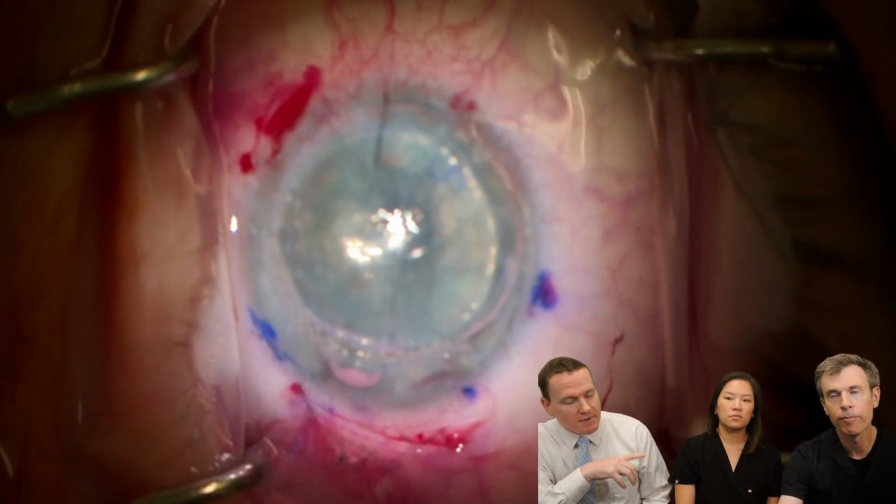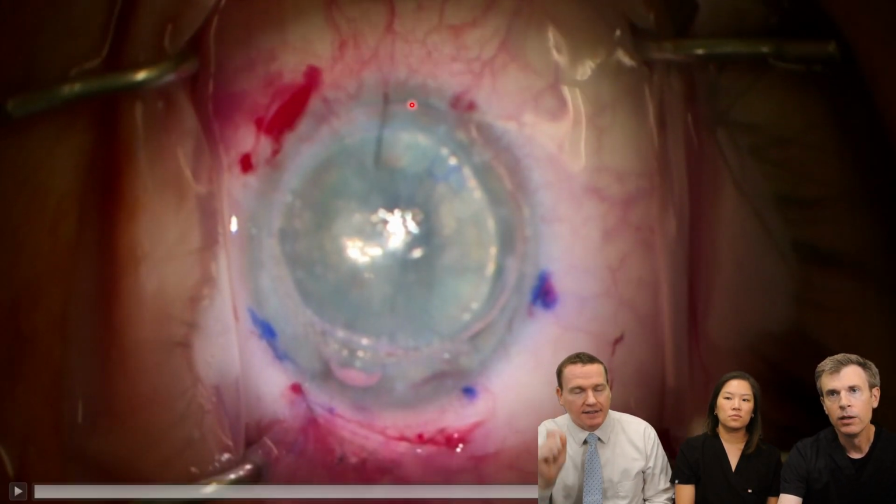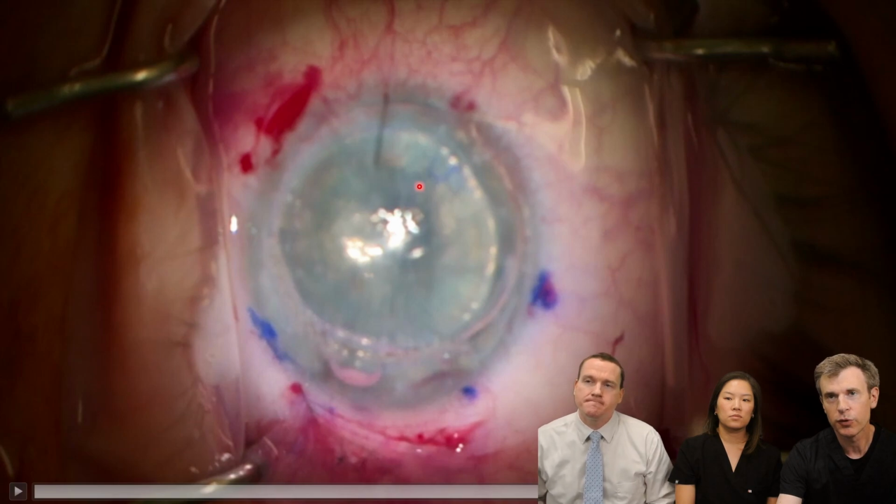We talked about stitches already, how long is that stitch staying there? This one probably a week, or as usual, surgeon answer: as long as it takes. You also see this S stamp, which is one way to identify orientation. It just tells you it's the correct side up.